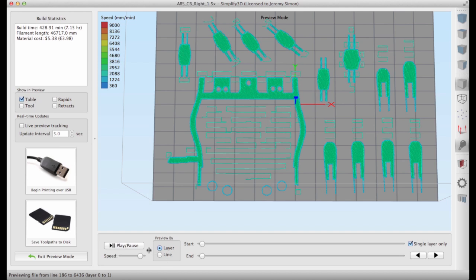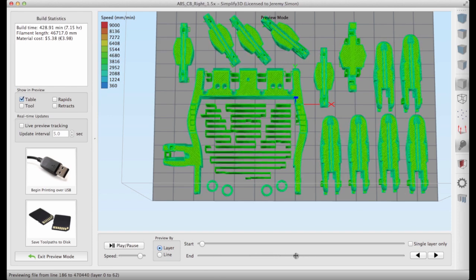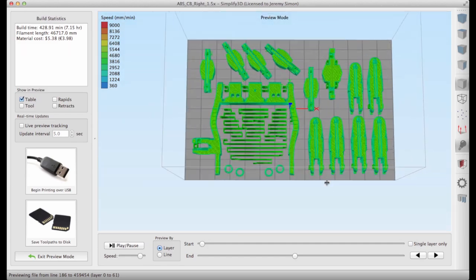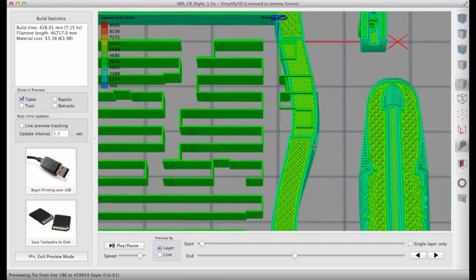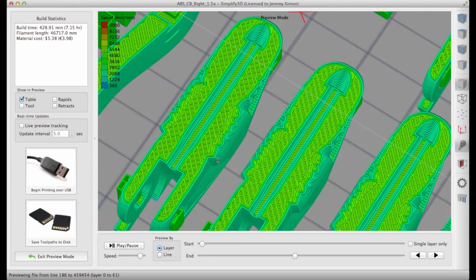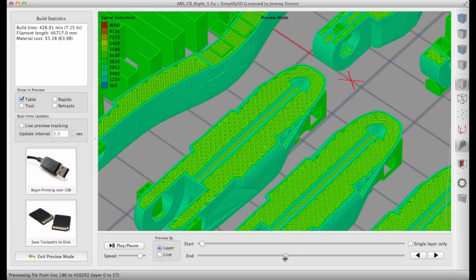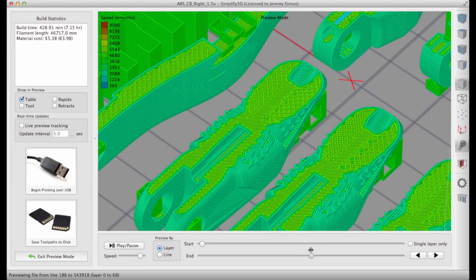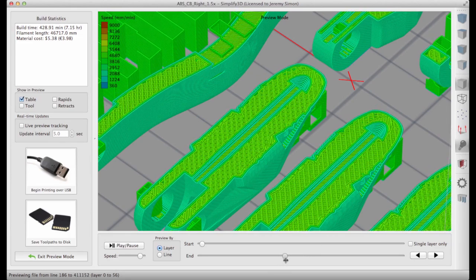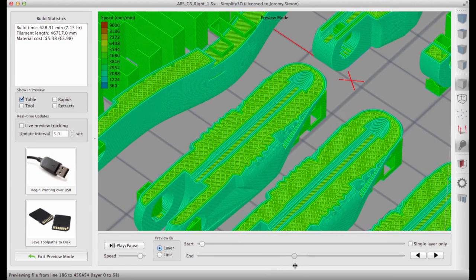And then you can go uncheck the single layer only, and we can now start to look at a range of layers. And this is very helpful to actually sort of scroll up through your print. For example, I'm going to zoom way in here on one of these finger parts. These fingers have these very challenging channels inside them where the cords have to go through that help them to move. And we can use this visualization to go through layer by layer and see very clearly that there's no support material going in those channels, which is exactly how I set it up using the custom support options. And so we know that it's going to print exactly the way that we want.